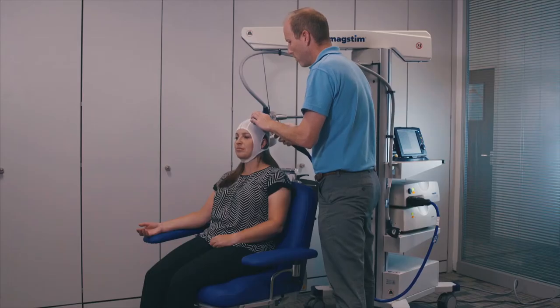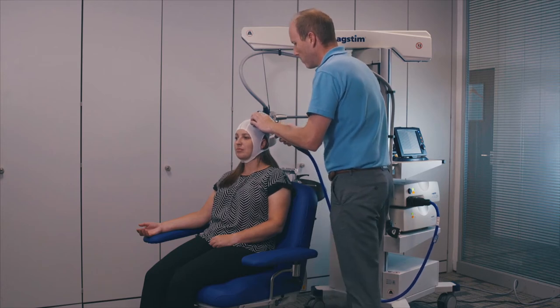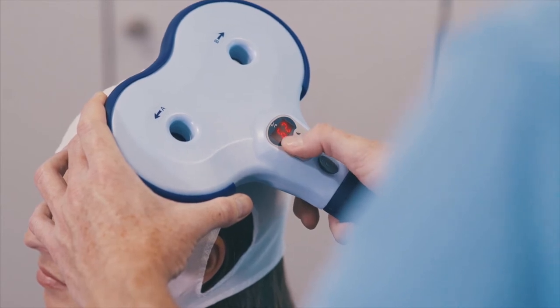Place the Horizon MT coil on your defined hotspot at a 45-degree angle to the midline, ensuring the coil is placed tangential to the curve of the head. Using the previously defined hunting power level, deliver up to 10 pulses, watching if at least 5 of 10 pulses produces a twitch.